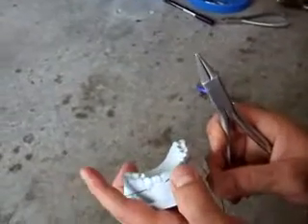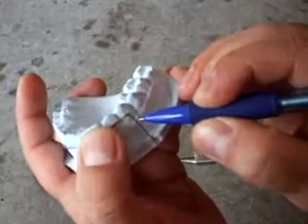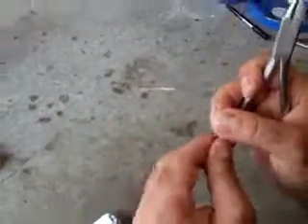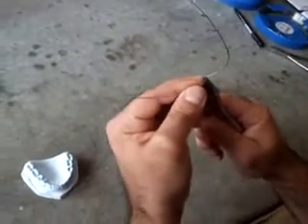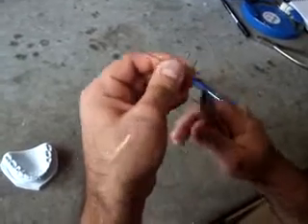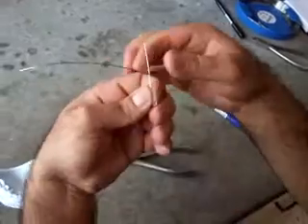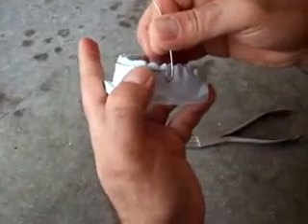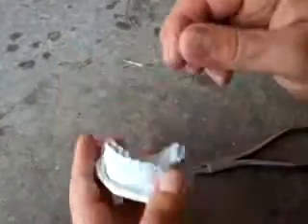Now measure where we have to do the coil, like this. We have to get away from the soft tissue here.